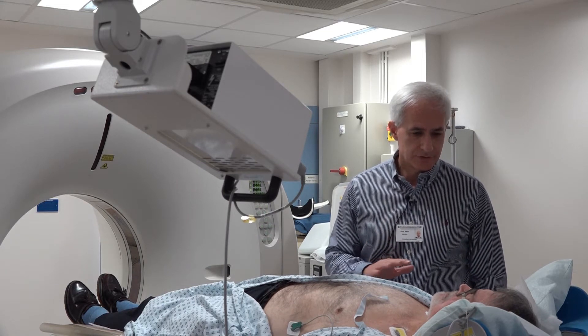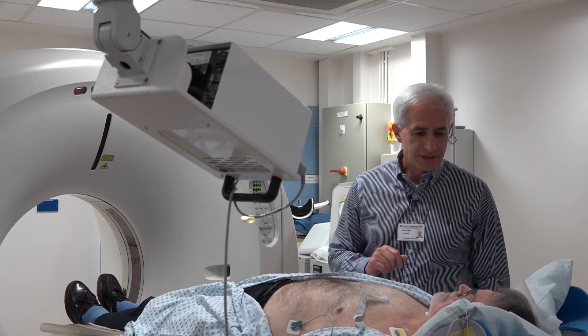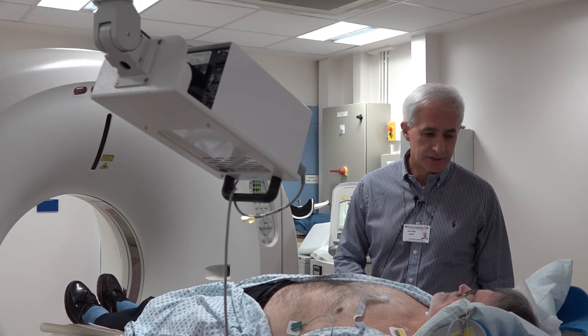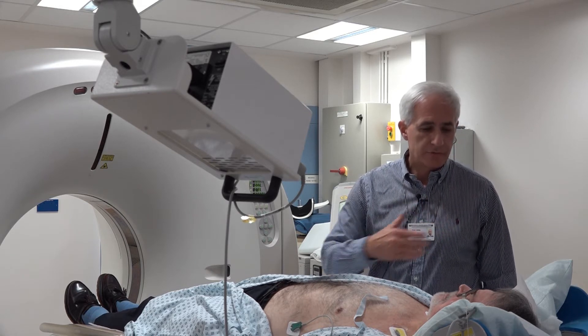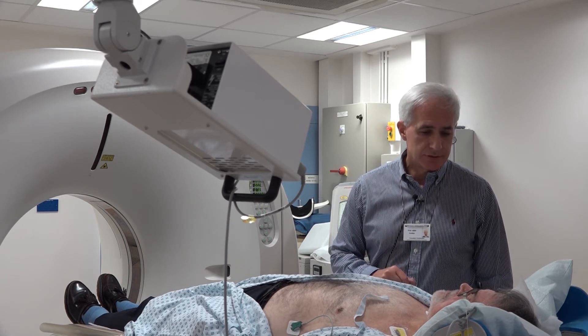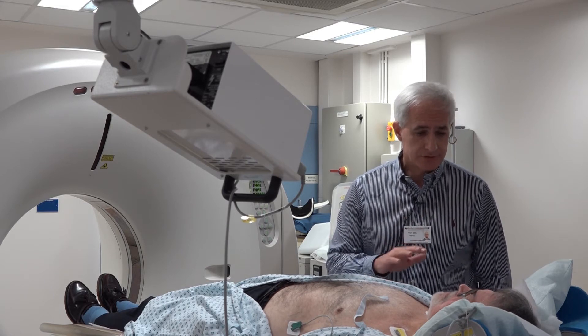One of them is to relax yourself as much as you can — ignore all the noise surrounding you, ignore the movement of the couch in and out of the scanner, and the hot flush sensation when the dye gets injected into your vein. From your scalp down to the pelvic area, the hot flush travels through and dissipates in a few seconds. That's normal — everybody who gets this contrast dye injected will feel exactly the same way. Just relax about it.